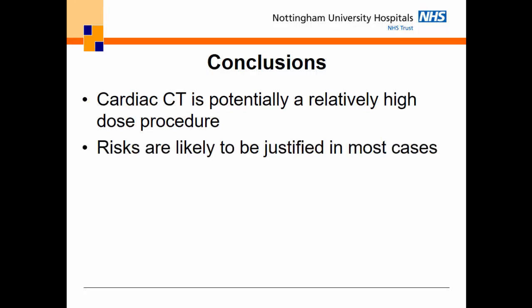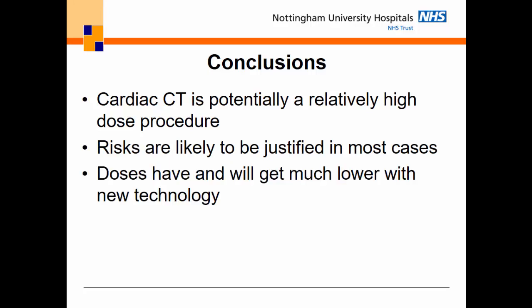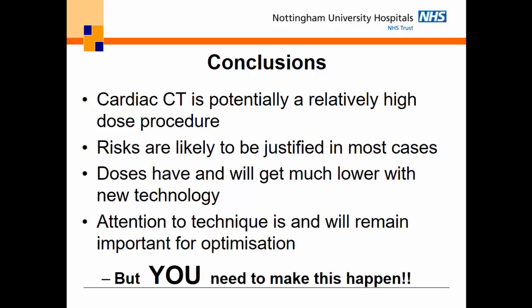The risks are likely to be justified in most cases. However, the doses have got much lower than they were, and they will get much lower with the new technology. But really, for this technique, attention to technique is really important and will remain important for optimization, and you have to make this happen.